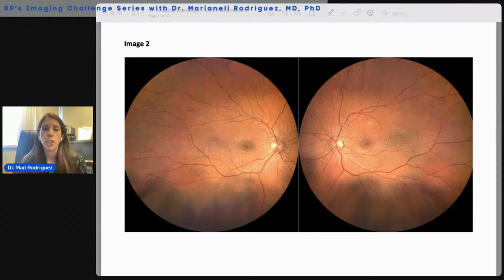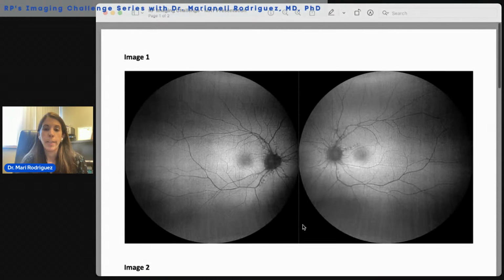These lines were more strikingly evident on fundus autofluorescence, which we can see here, where they appeared as radiations from a ring-like area of mixed peripapillary hypo- and hyperautofluorescence mottling. So, of course, these lines represent angioid streaks, which result from breaks in a weakened Bruch's membrane.